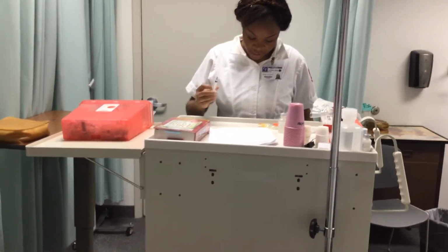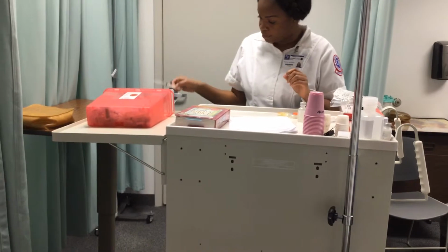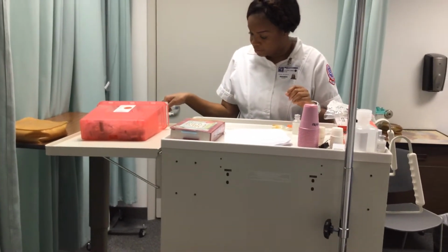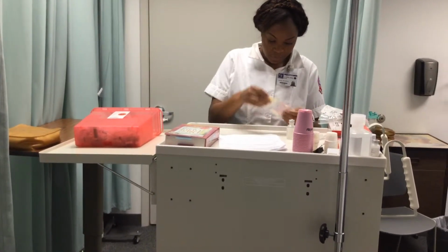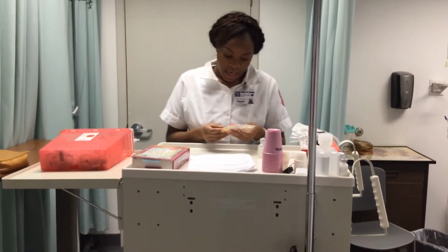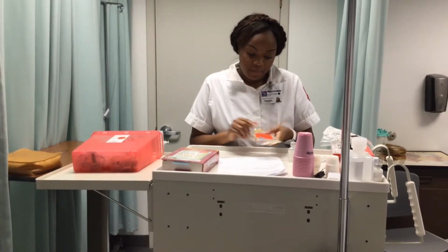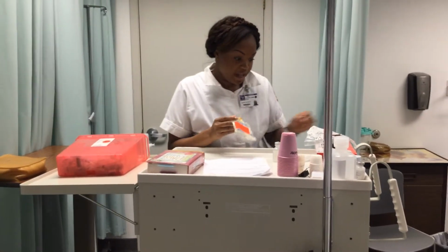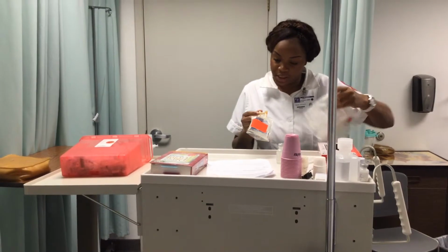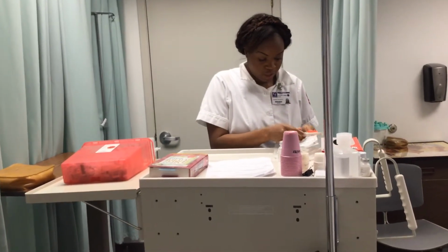All medication has been injected. Recap. And I will put my syringe in my sharps container. Go ahead and lightly toss it to mix the medication. Again, the medication already has been labeled with the gentamicin 80 milligrams. I'm going to just go ahead and compare it again, and I'll take everything and I'll head over to the patient's room.